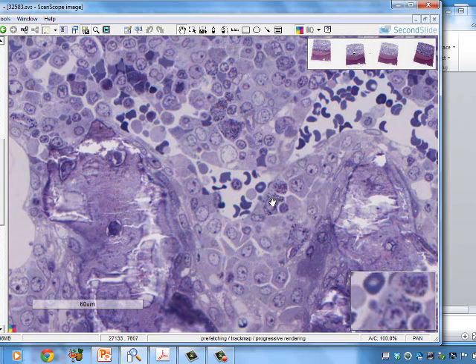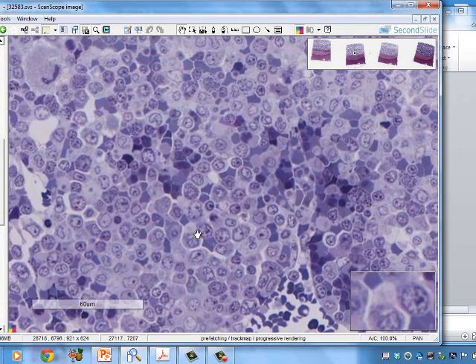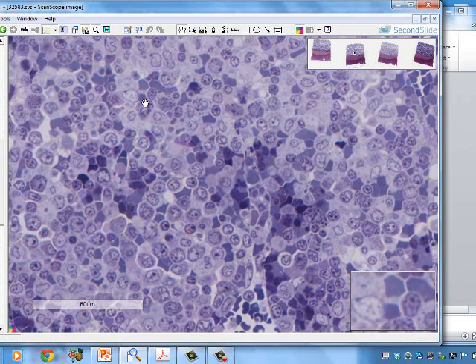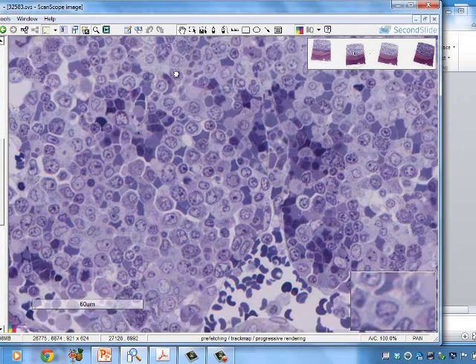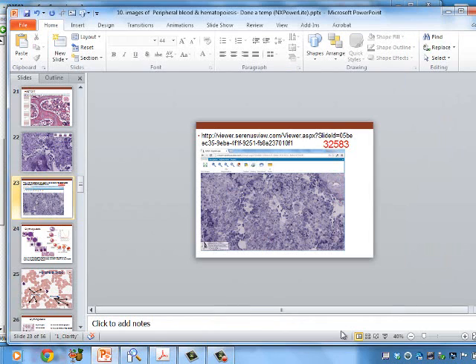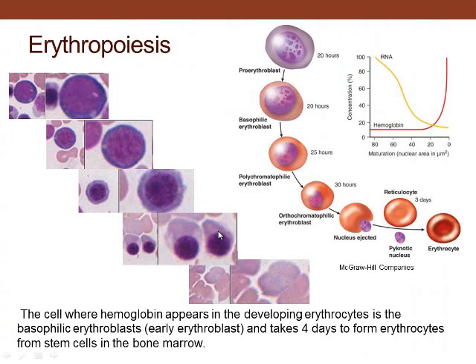These cells are immature cells that are being developed in the bone marrow. We can see these dark cells in through there, with dark nuclei, and sometimes no nuclei. Those are from the red blood cell series, but from the granulocyte series, you can see the big granules located in through there. And so that's what you can see in the bone marrow as a source of these cells.